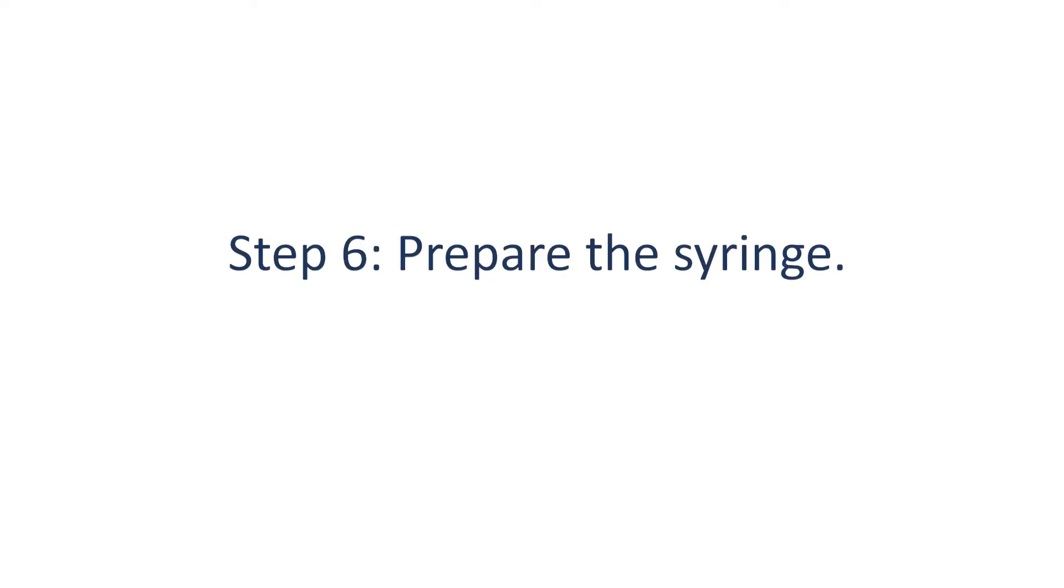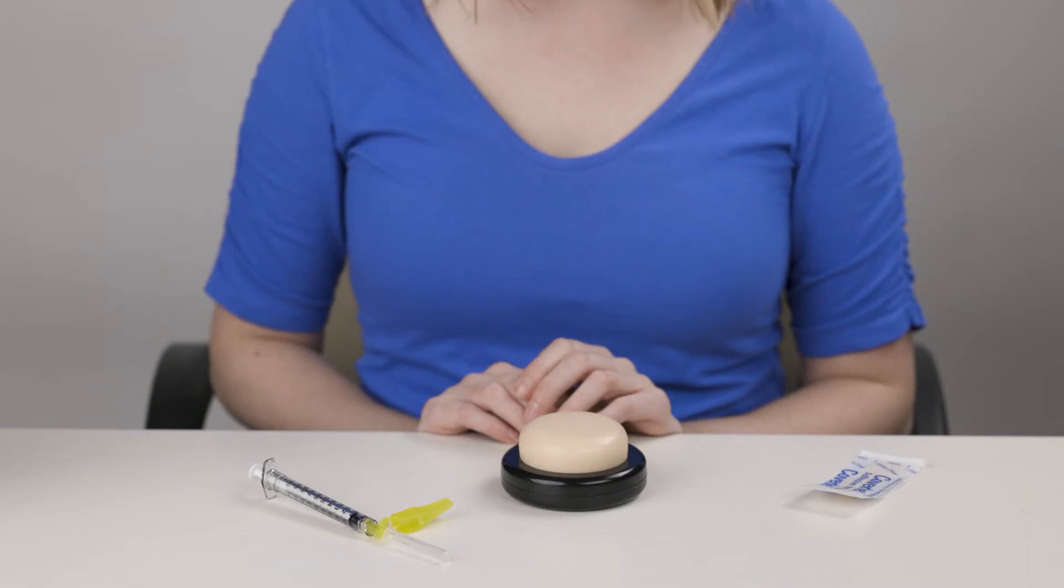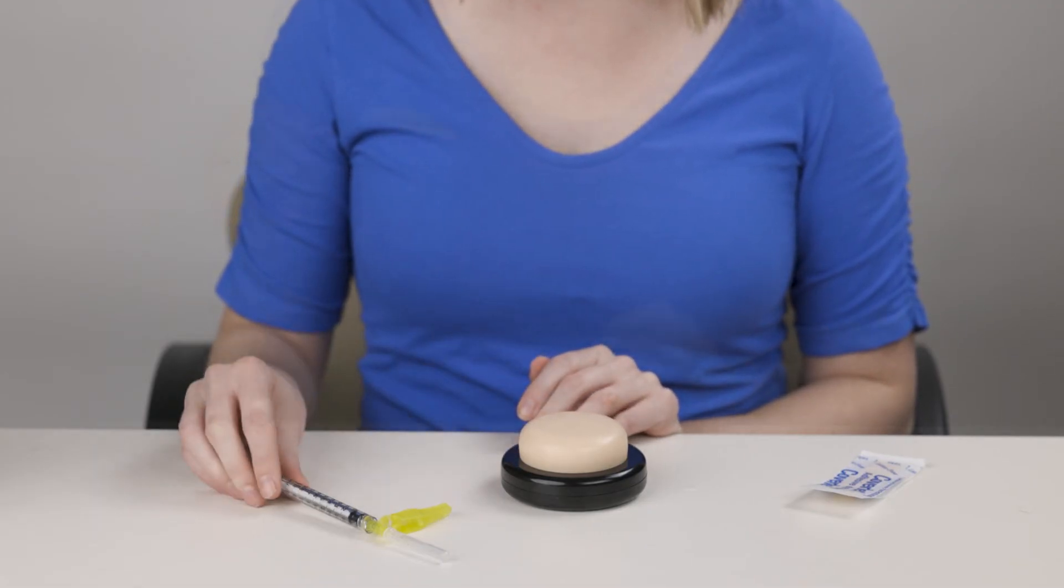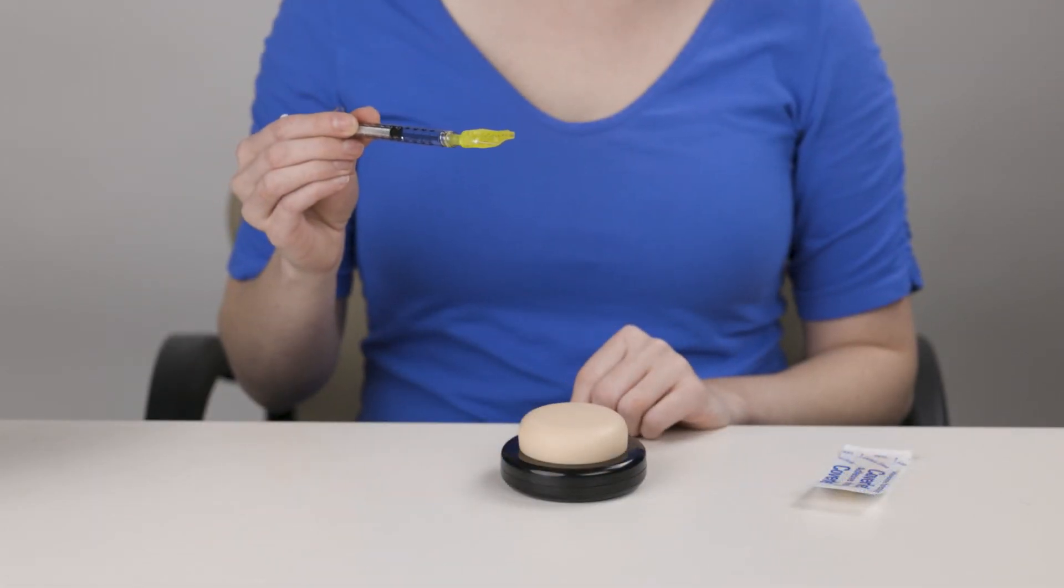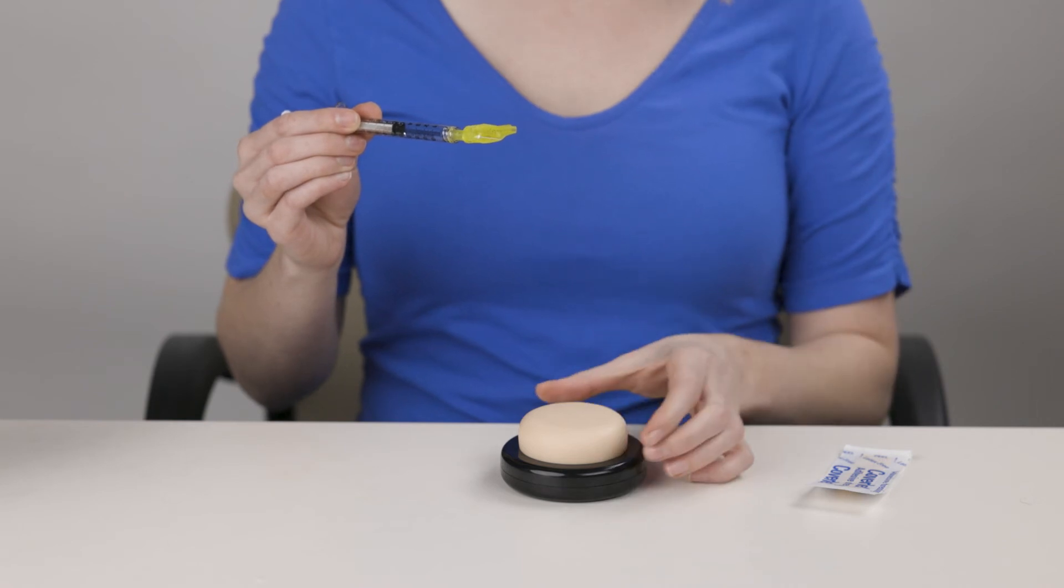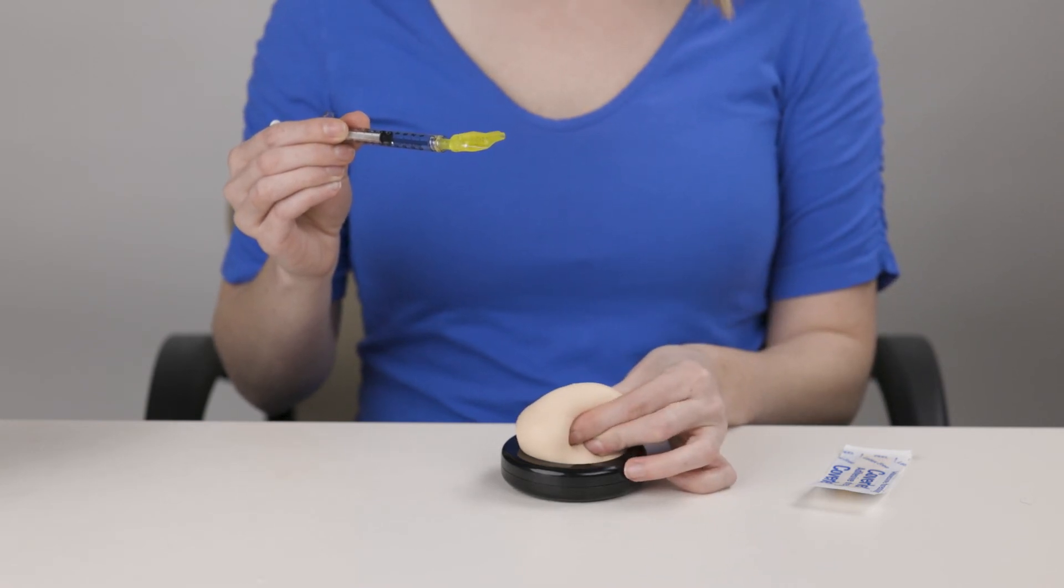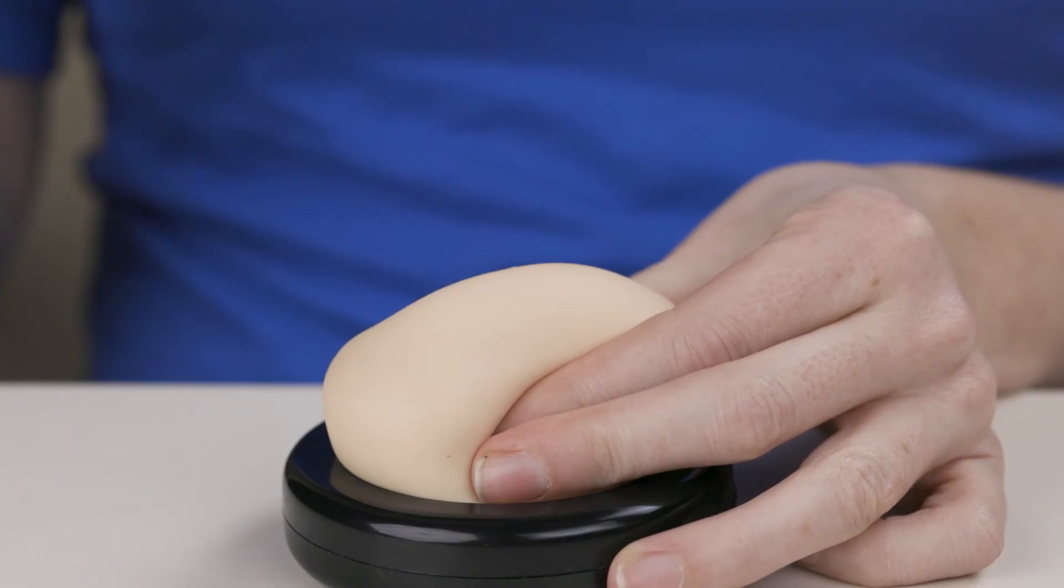Step six, prepare the syringe. Using your dominant hand, which is the hand that you write with, hold the syringe around the middle like a pen or dart. With your other hand, gently pinch 2 to 3 inches of skin and fat tissue.